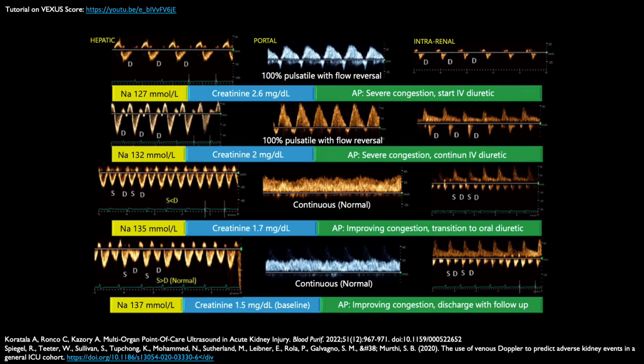This is a bit more of an advanced concept, but we will touch on it briefly here. Remember how we mentioned at the start of the presentation that our volume assessment can answer whether or not there is organ congestion? While we assessed the lungs and the heart for congestion previously, we will now use a different ultrasound modality to assess congestion in the liver and the kidneys.